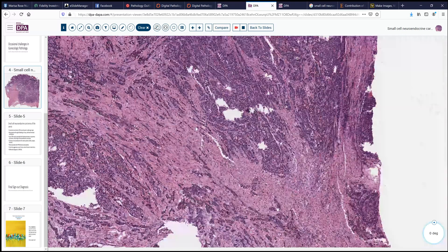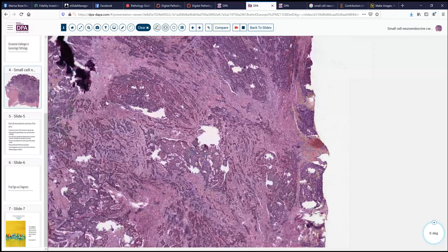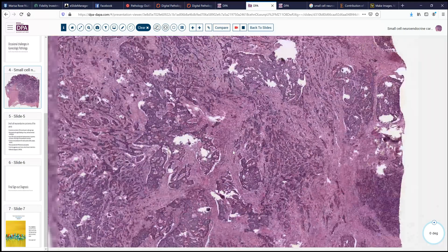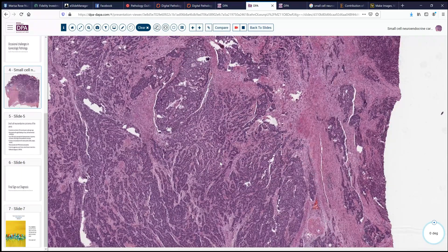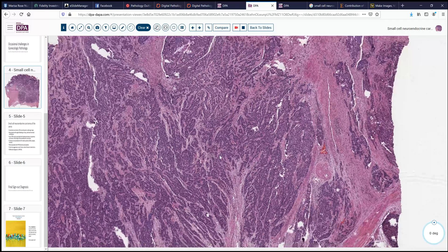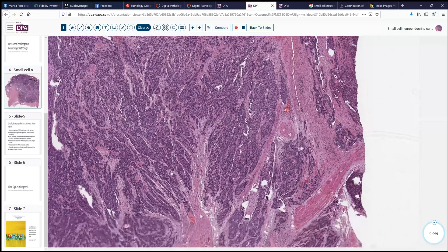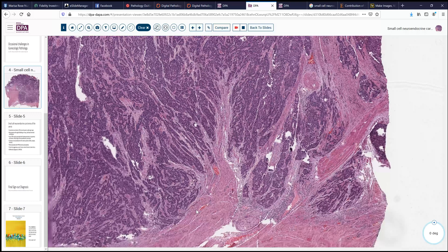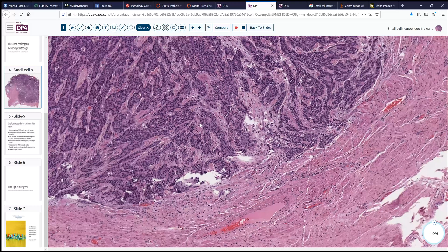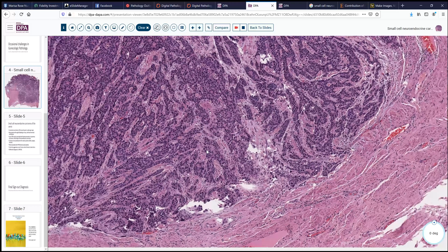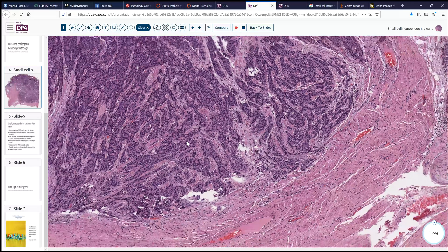Immunohistochemical stains will help. P16 will not particularly help us here because that will be positive in everything — this is probably an HPV-related tumor. But we might do some neuroendocrine markers, choosing one or several to evaluate this tumor. We would also want to do some glandular markers, making sure this was not an endometrioid type tumor with small cell differentiation. Looking at Pax8, Vimentin, and hormone receptors might also be useful in this scenario.